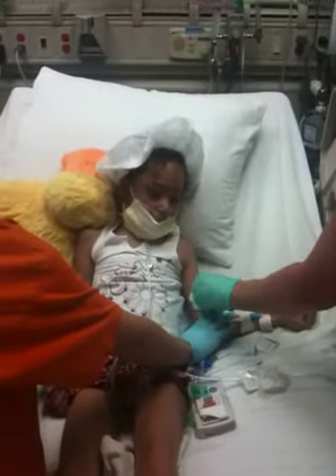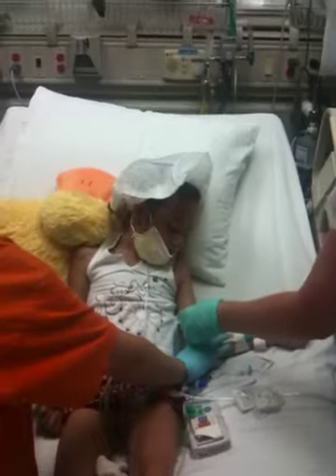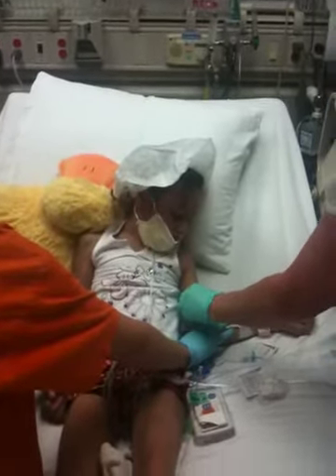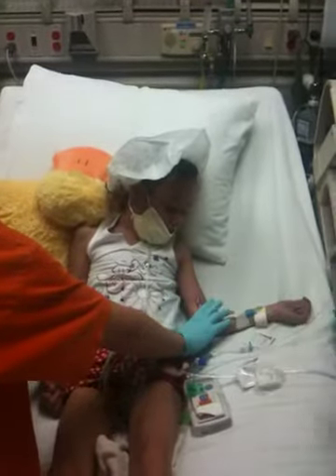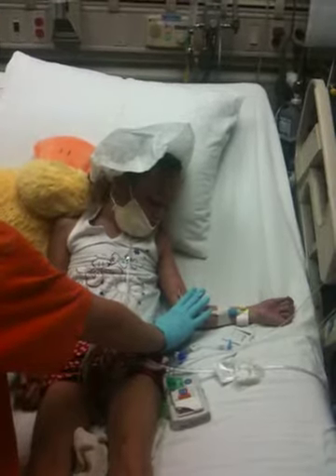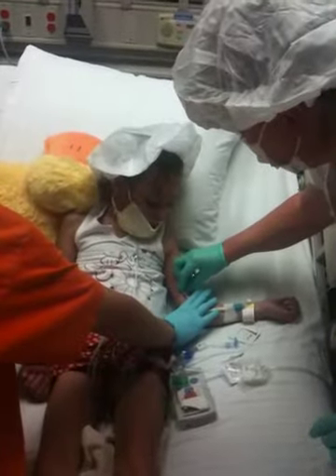Where are we going to put the biopatch on? We are just about to. We're going to dry it off again. And what do you always tell them, Dakota? Careful. Don't forget the safety dot. That's the biopatch. Biopatch, the safety dot.